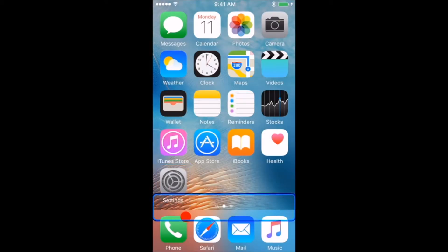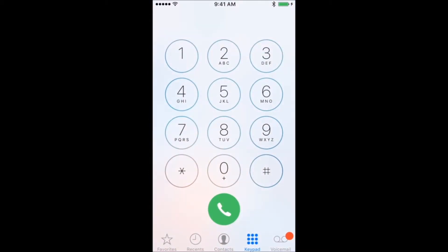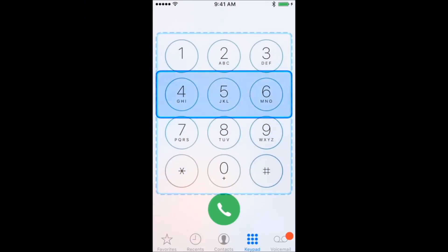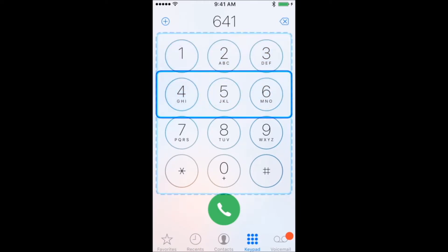To place a call, you need to go to the phone application. Wait for the auto scanner to highlight the keypad and press the switch once. The scanner will then highlight each row of the keypad. Wait until the auto scanner reaches the number you are interested in dialing and press the switch once. Repeat this for each number.